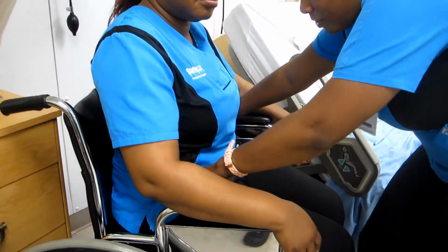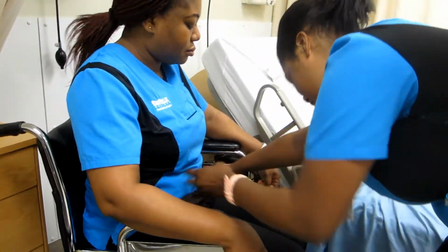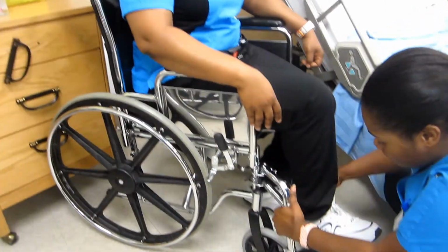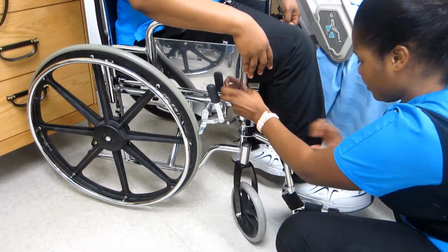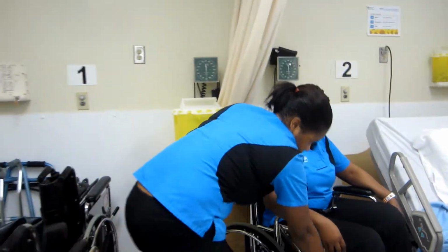Okay, so I'll double check, make sure it's 2-finger space between. Okay, you're good. And I'll just get you to kind of lift your feet up. Okay. There you go. Just going to release the brakes.